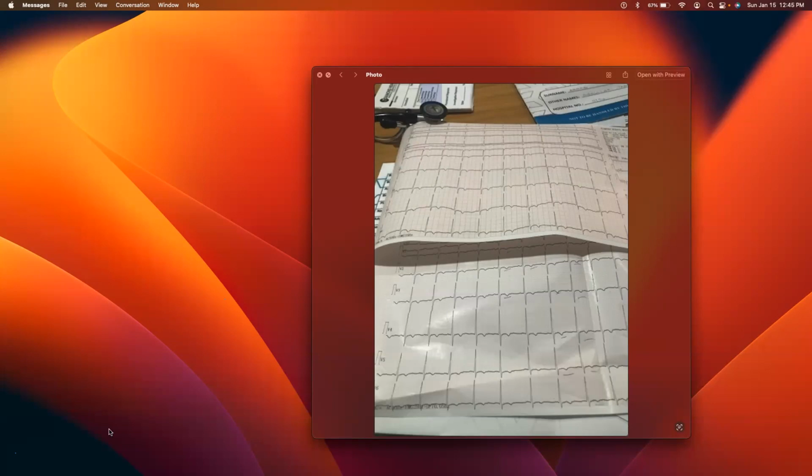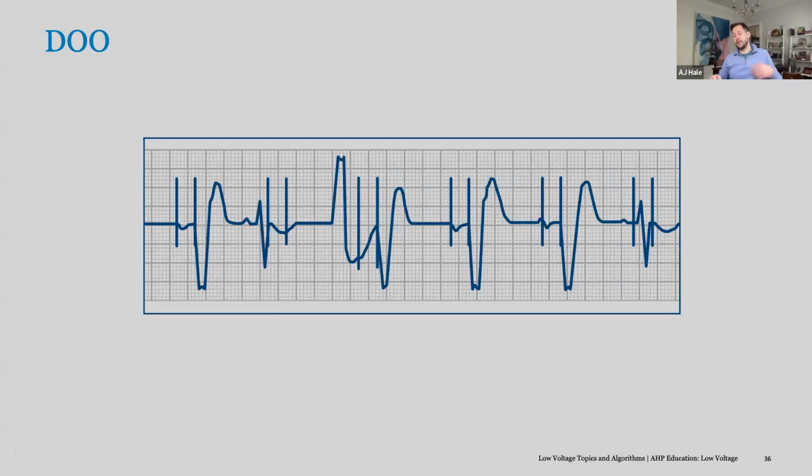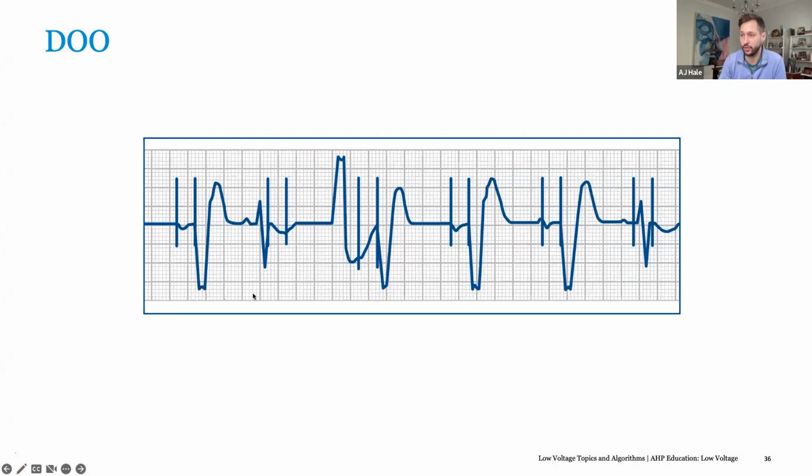In general, pacing in the ventricle can contribute to heart failure. So pacing greater than, what is it, 40-50% of the time, that's actually an alert in many devices that you can toggle on and off. The reason being, you can eventually contribute to their heart failure symptoms, and then we do end up having to put a CRT in them. So in this case, they have intermittent issues. They have their SA node, AV node, His bundle, and then conduction system to the ventricles. And this all seems to be functioning fine right now.